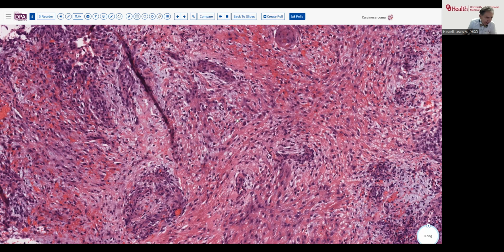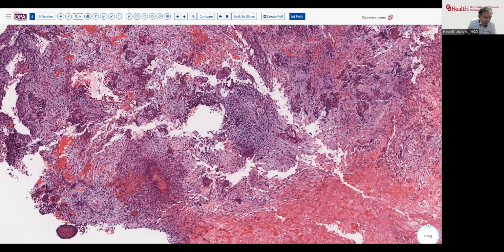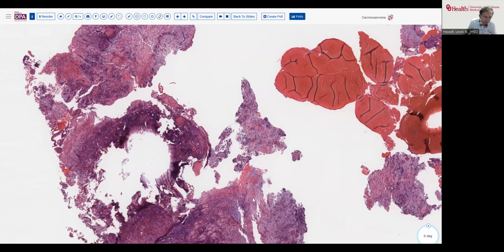Now, could this just be radiation change, kind of the gynecologic equivalent of sialometaplasia? I don't think so. I think the atypia here is too great, both in the stroma. Here you see a fair degree of atypia. You see some atypical single cells. We didn't see actually identifiable strap cells or things like that, but this is not the clustered pattern of pre-existing glands with a sialometaplastic type of change. This is recurrent carcinoma with so-called divergent or carcinosarcomatoid differentiation in this patient.